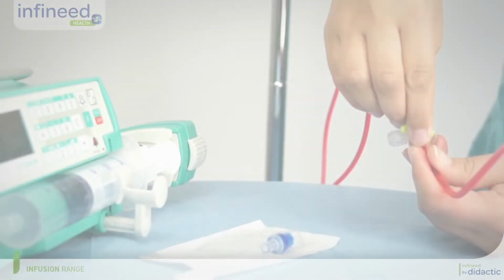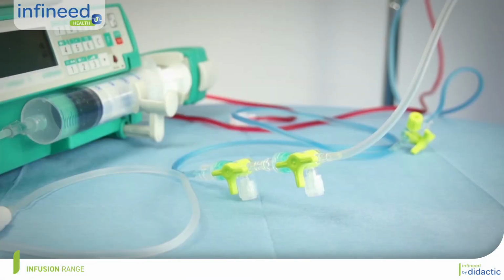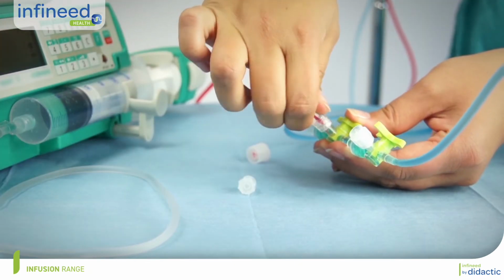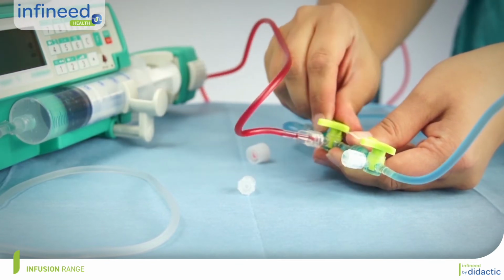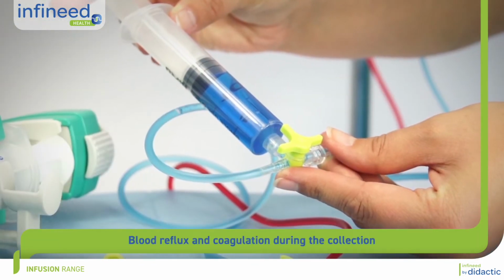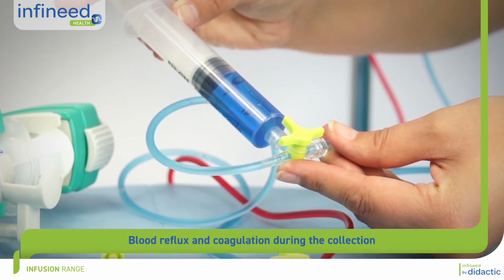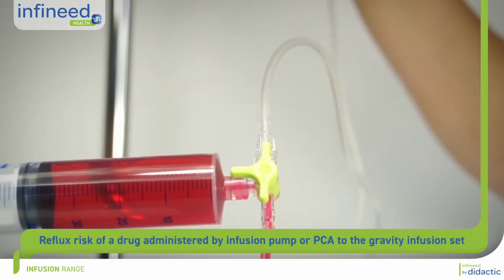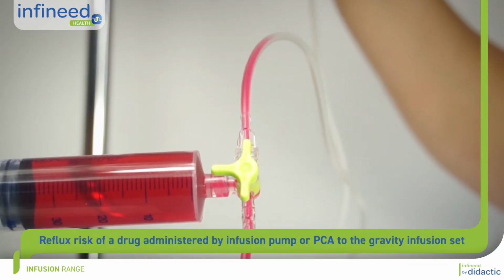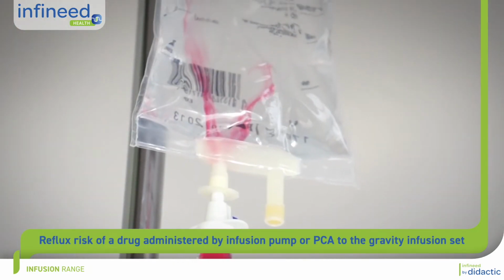The need to administer parenteral treatment increases the number of manipulations of the infusion lines in place. The risks associated with infusion handling are the risk of gas embolisms, the risk of infection, the risk of exposure to blood, the risk of catheter occlusion, but above all, the risk of anarchic administration of molecules with a narrow therapeutic index requiring precise administration.